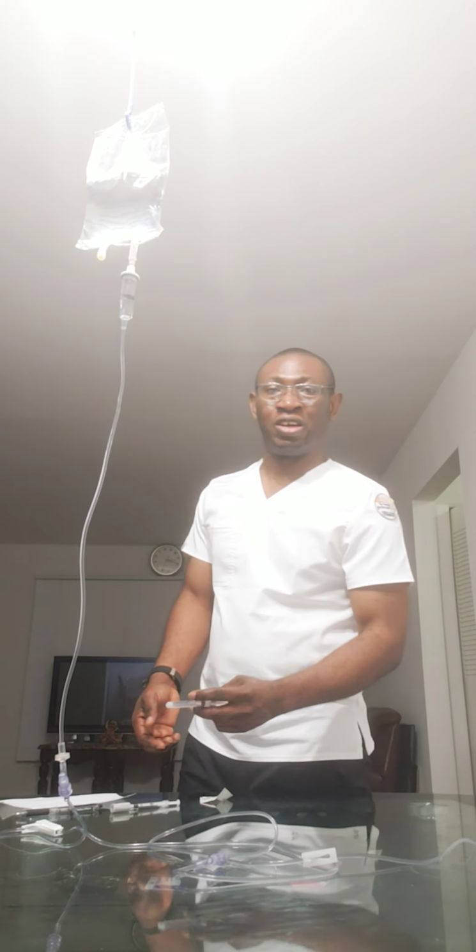Flush with normal saline, clean again with my swab, administer the medication slowly as prescribed, clean with the swab, then flush with normal saline.